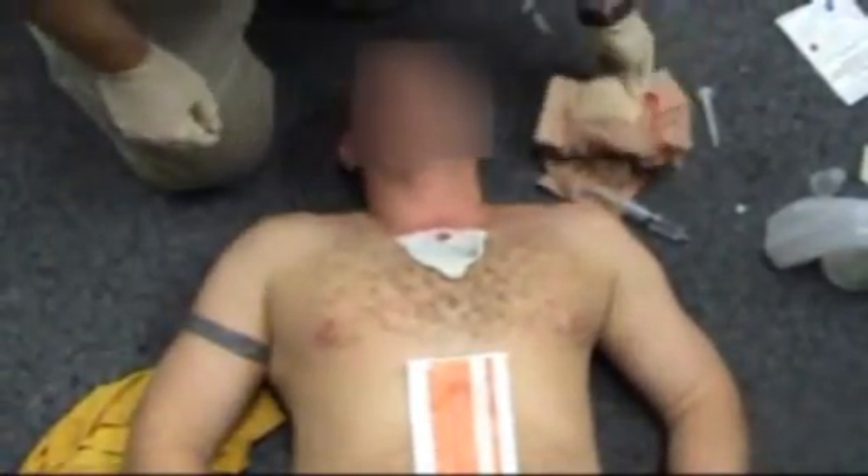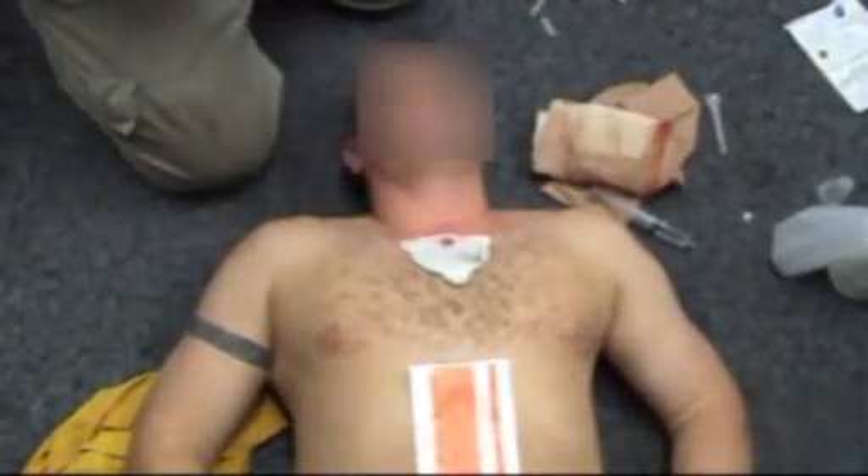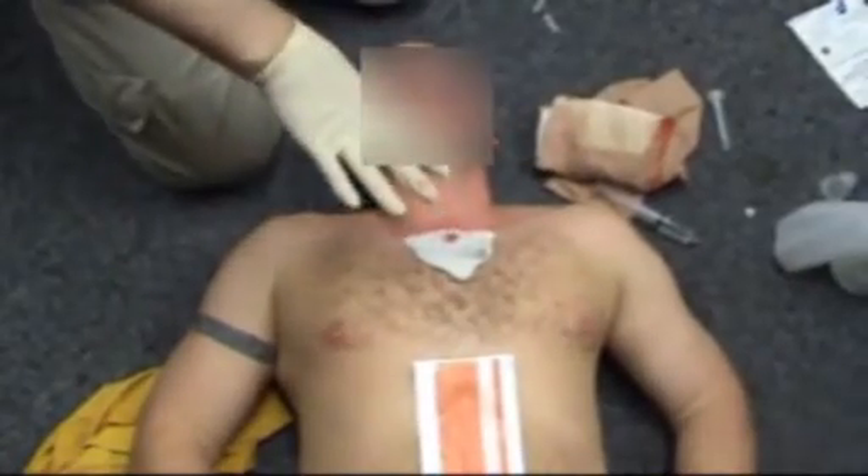It's a good piece of kit. Was that a painful chest? He was stuck on all being in there earlier, wasn't he? So what we'll do is take it out. Everybody happy with that? How quickly would the patient respond to the actual fluid? Compared to, for example, IV? No difference — this is just exactly the same as putting in a central line or any IV line close to the heart. So if you put an external jugular in, it'll get into the same circulation. It takes about 21 seconds to get to the heart from the sternum.